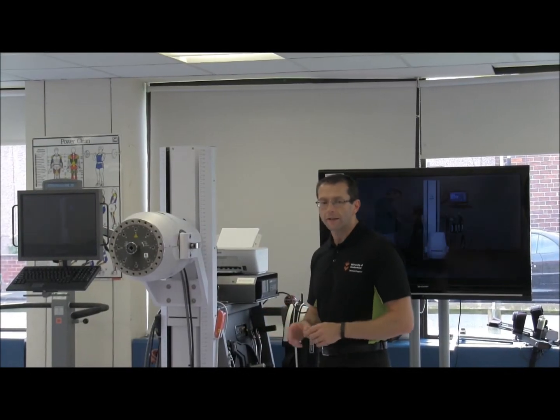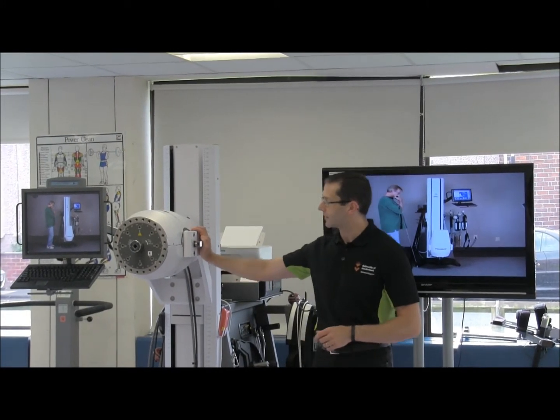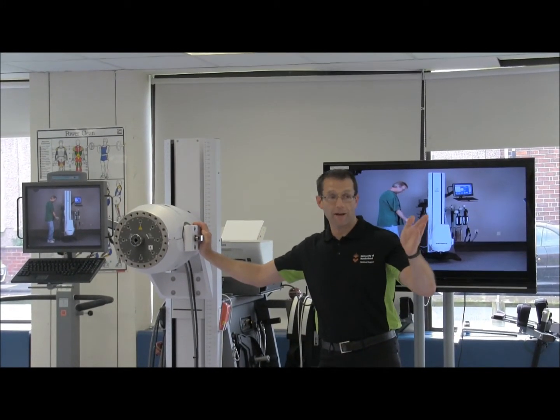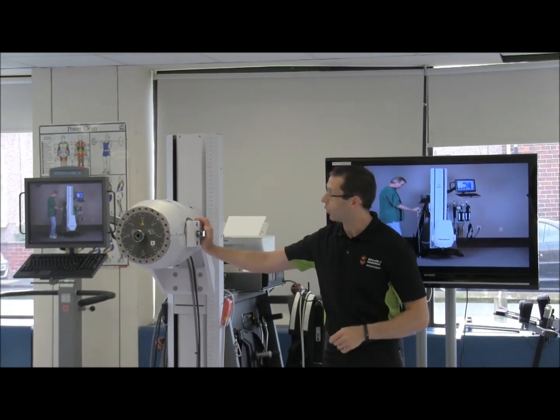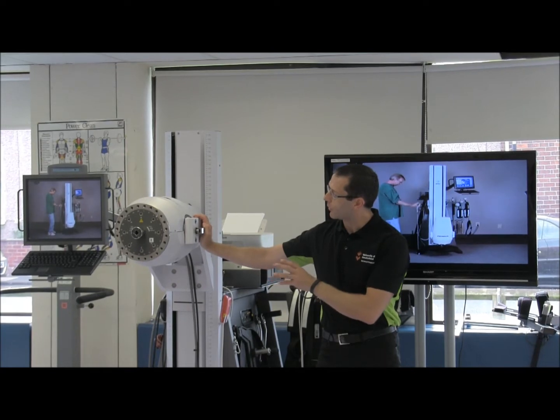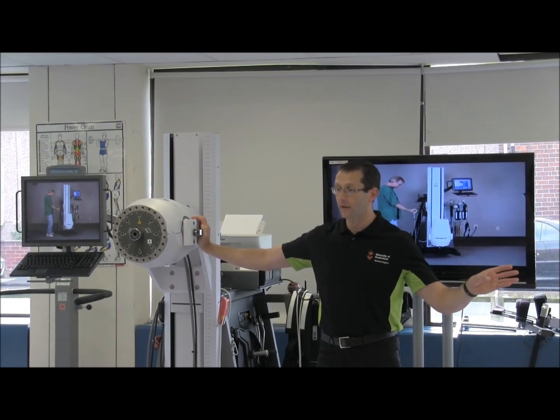When we looked at upgrading, we ended up looking at the BTE Primus instead. Our physiotherapist, who teaches here at the university in our sports medicine courses, had a look at this system as well, and we thought this actually gives us a little bit more flexibility nowadays than the old dynamometers.